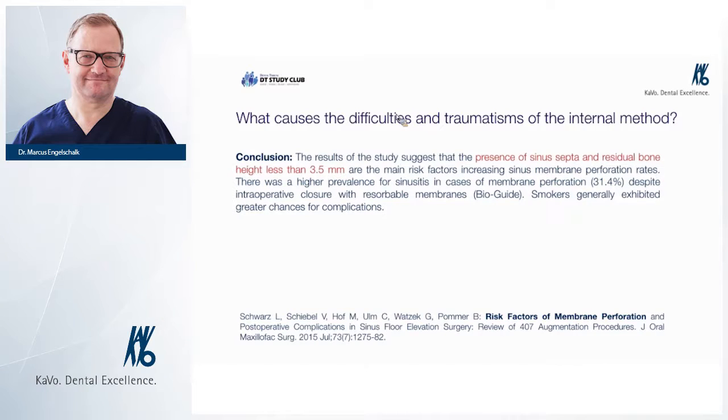But there's no feedback system. You never know if you're successful or not. And remember, I told you on the X-ray, you will not see it. If you have perforated your membrane and you have your augmentation material in the sinus and it's going everywhere, then you're sure, even on your X-ray, that you perforated the membrane.